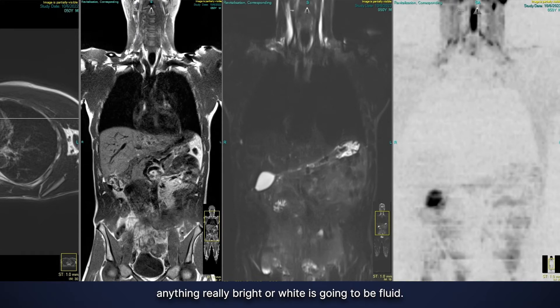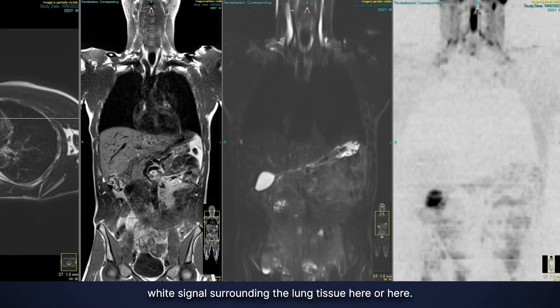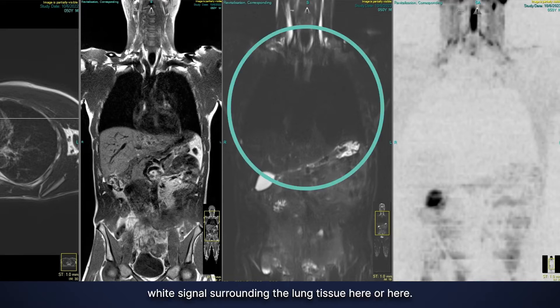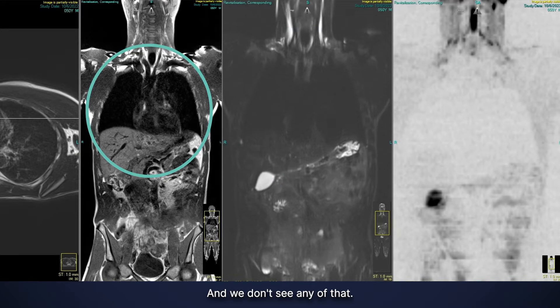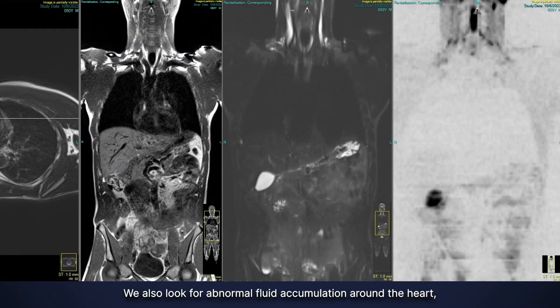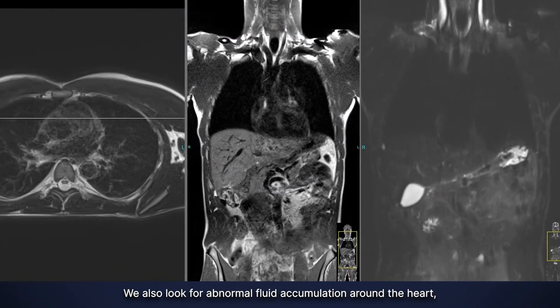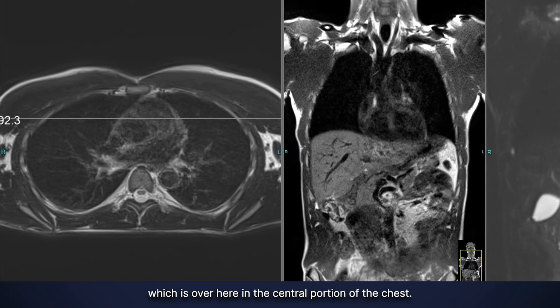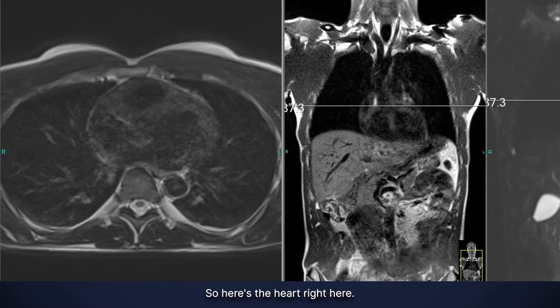So if we saw abnormal fluid around the lung, we would see that white signal surrounding the lung tissue here or here, and we don't see any of that. We also look for abnormal fluid accumulation around the heart, which is here in the central portion of the chest.